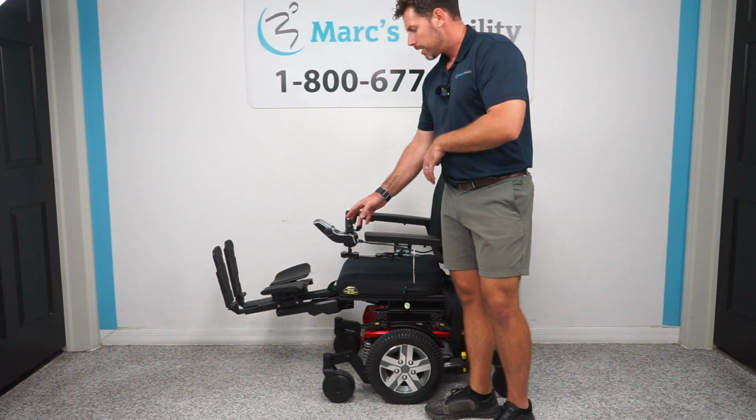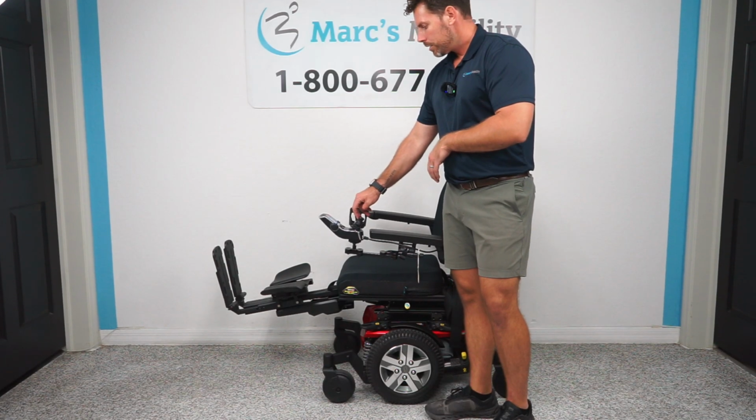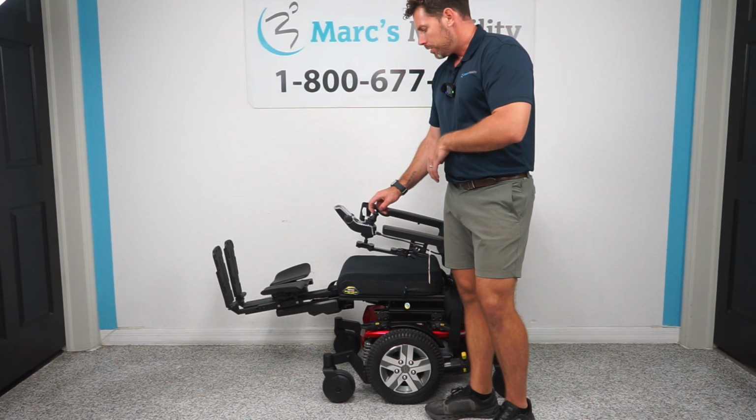Now as the tilt comes almost all the way back down, now I can do the electric recline. Electric recline is going to be pretty straightforward. That is going to be just your back going backwards. So this is going to show you that kind of lay flat position here on this particular unit.